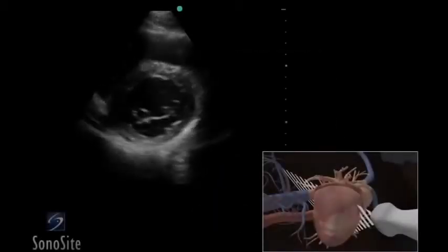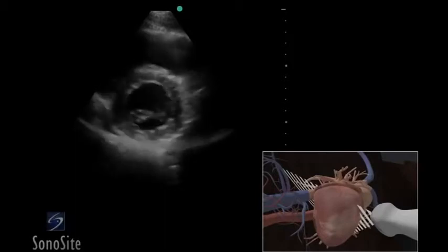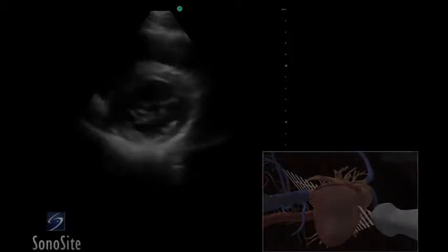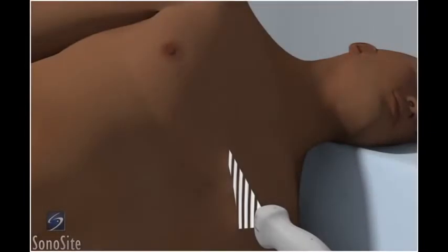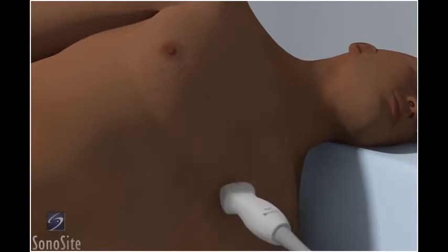A phased array transducer with a cardiac exam type is used to perform the parasternal short axis view of the heart. If possible, place the patient in a left lateral decubitus position to reduce any lung artifact and to bring the heart closer to the anterior chest wall. Place the transducer at the third or fourth intercostal space immediately left of the sternum.